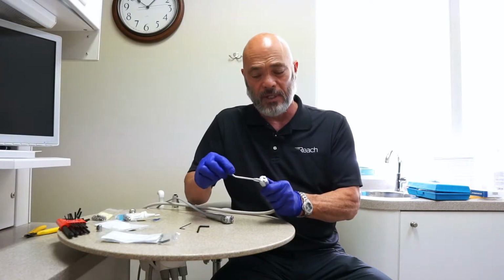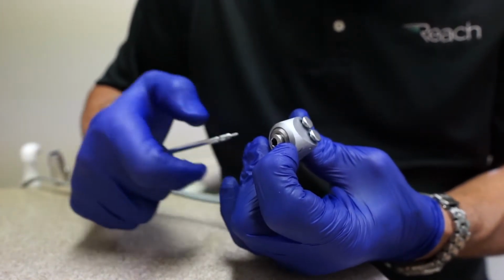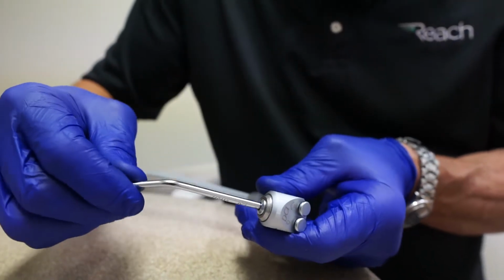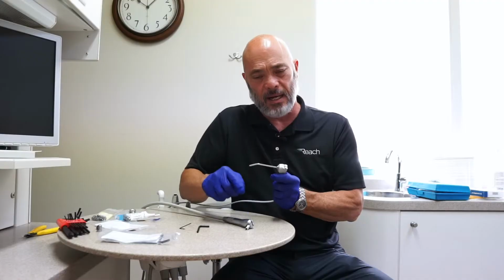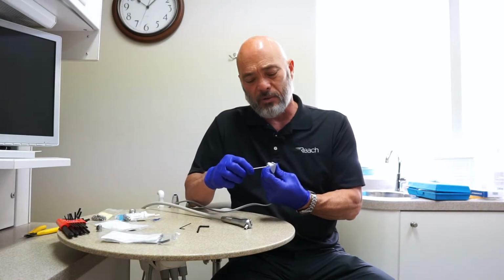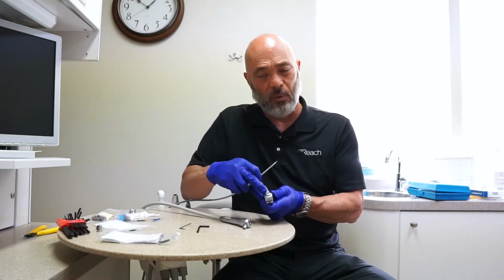Okay? Again, free spinning. Another syringe is a DCI syringe, has an internal nut assembly. Okay, this one here, you just push in on the ring, insert the tip. Again, it's free spinning. Okay, so you can't really retract. It's a little bit more resistance than the ADAC one, but still you can't really retract. If you want a retractable syringe tip where it's rigid and stays in place, you can order special tips from DCI that will work with this.